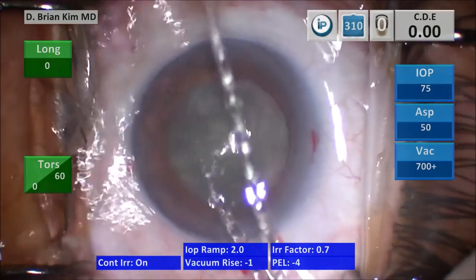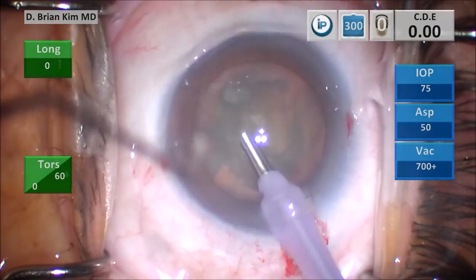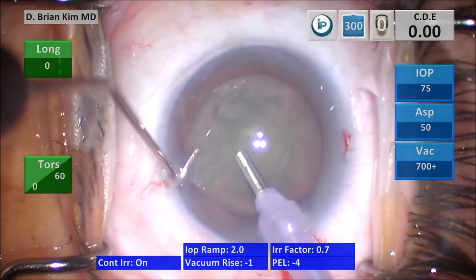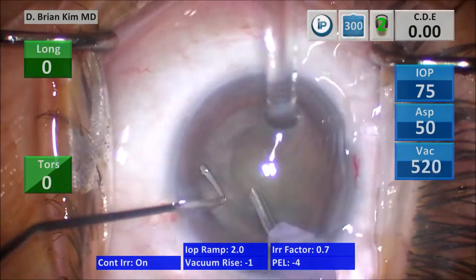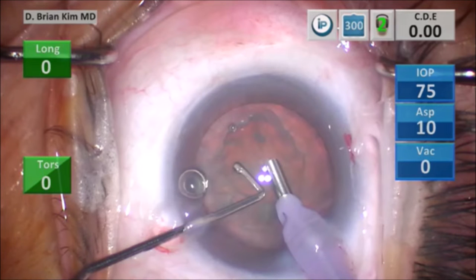Let's look at a case. I'm going to lift the incision with my chopper and go in with irrigation off to minimize descemet's trauma. I'm going to remove the surface central epinuclear material, and as I do this, you can see there is a round delineation of the removal of the epinucleus that I've done, and this is going to be where the epinuclear ridge is.